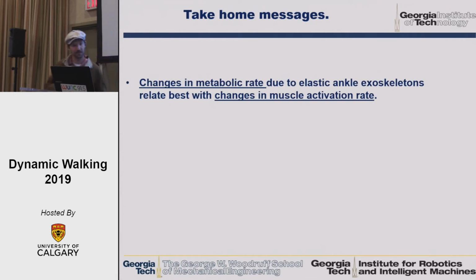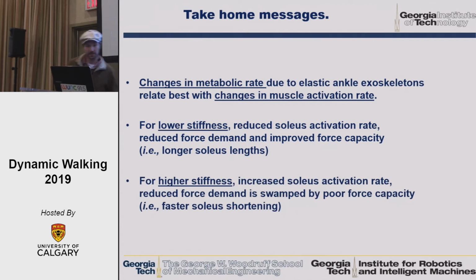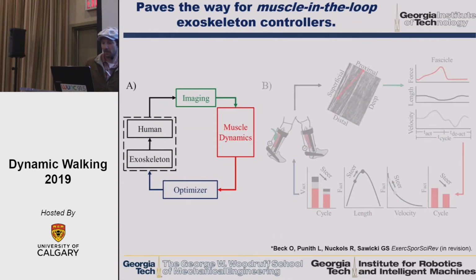Okay, so just to finish up, we found that changes in metabolic rate were pretty highly related to changes in the muscle activation rate of the soleus only, which was pretty cool. That's one muscle. It's a big muscle, but we were able to show about 44% of the variance just by looking at activation rate of soleus. For lower stiffness, the reduced activation rates could be tied back to reduced force demand, but also improved force capacity, which is really cool. For the higher stiffnesses, the increased soleus activation rate was due to the force demand being swamped out by poor force capacity due to highly increased shortening velocity.